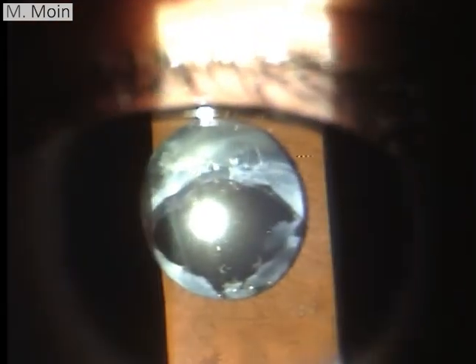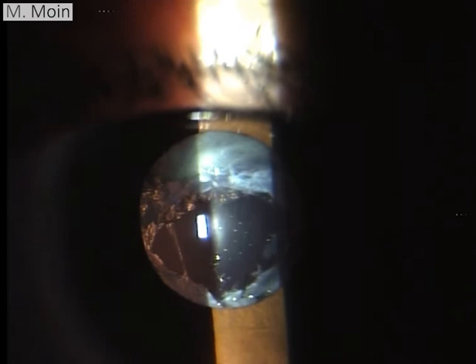So in order to see if the patient can see through this type of capsulotomy, usually the pitting is not very significant for the patient. They usually are able to see clearly through this.